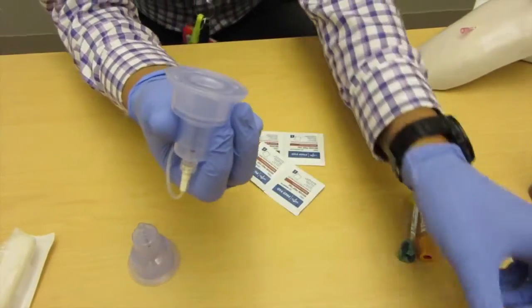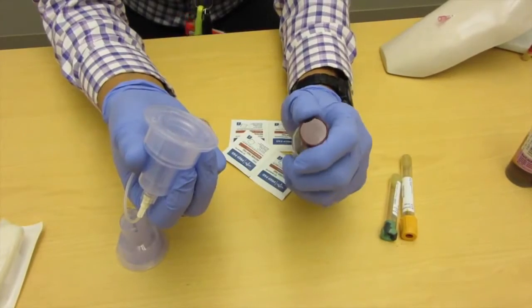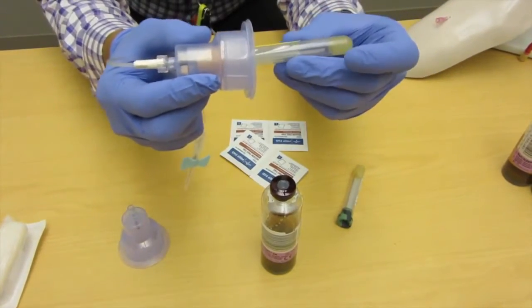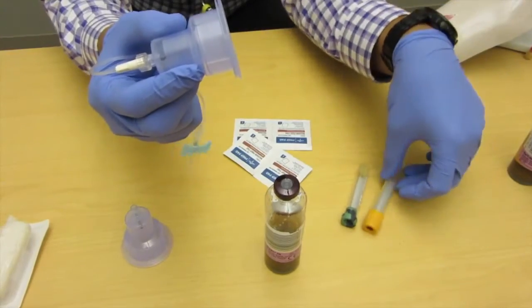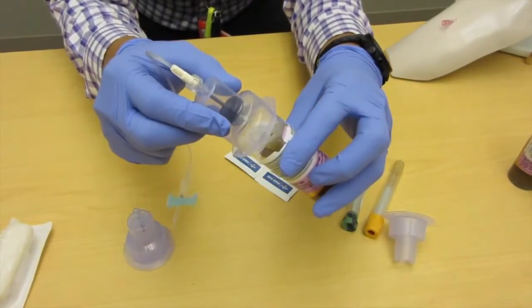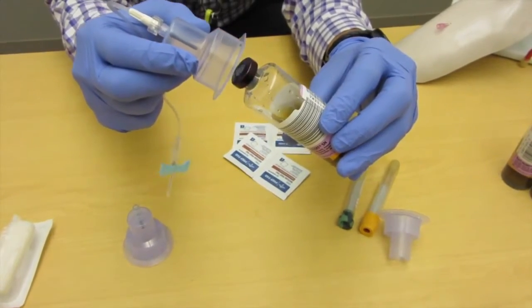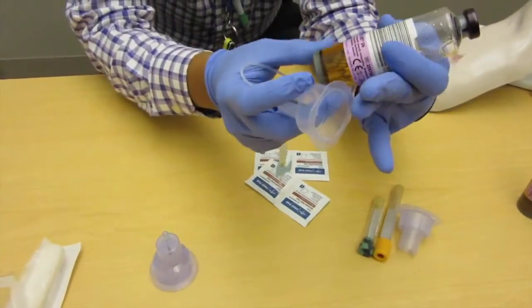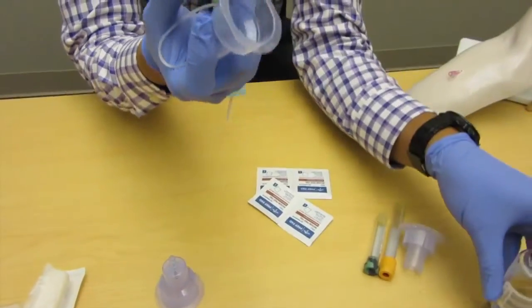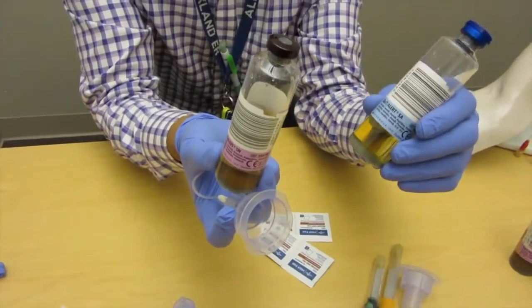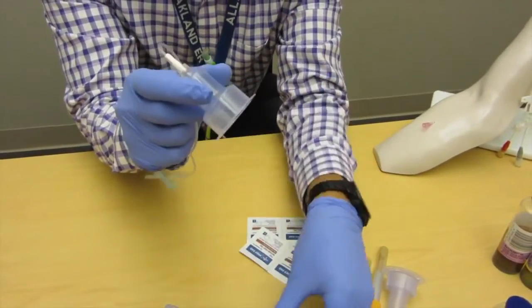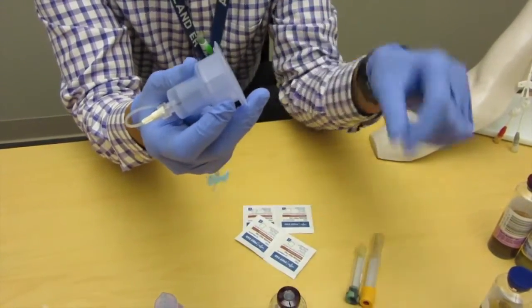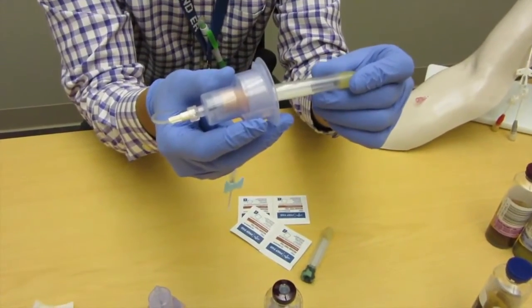I want you to take a look at the bottles and how this works. I'm just going to pop this off for demonstration purposes. This goes under—you can use this for both the bottles and the tubes. You want to collect your blood directly from the blood tubes, and once you're done collecting from the tubes, go directly to the bottles. Actually, I have it backwards. What you want to do first is get your bottles first. Get your bottles first. There's two bottles: anaerobic and aerobic. You want to get your anaerobic first and then get your aerobic. Anaerobic is red, aerobic is blue. Get your anaerobic first, get your aerobic, and then when transferring it over, connect this adapter right on the side. It's already built in, and this goes right inside there just like that.